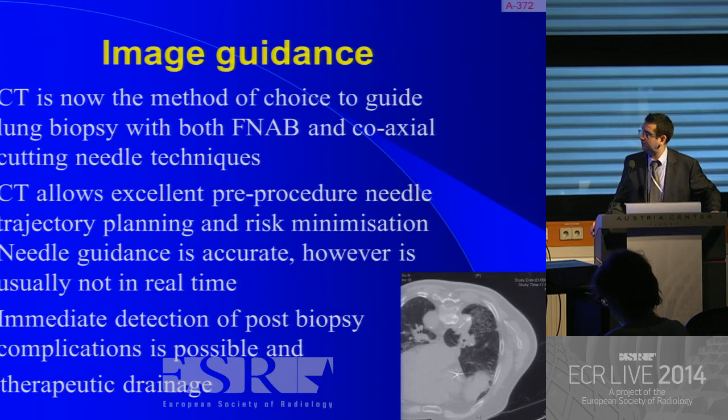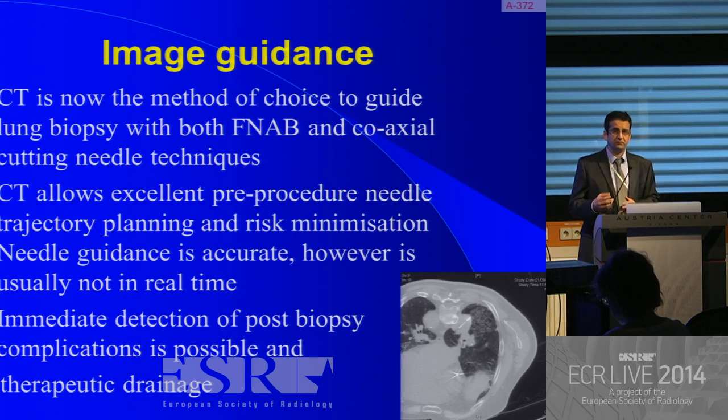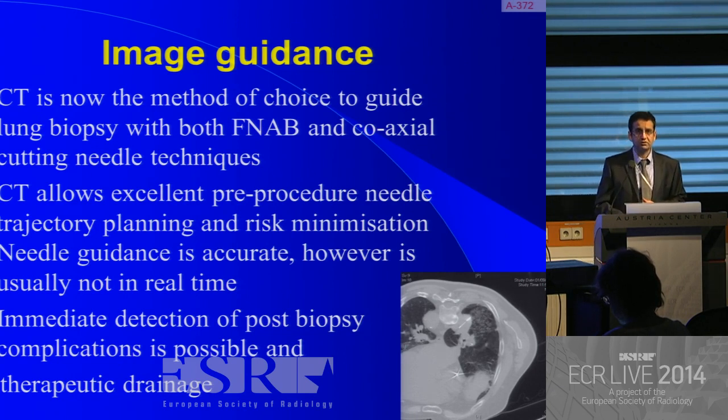CT now, as the chairman has said, is the main choice to guide lung biopsies, although there are other imaging modalities as well, both for fine needle aspiration and coaxial cutting needle techniques. Why is CT good? Because it gives us great pre-procedure needle trajectory planning, and you can use that to risk minimize the procedure. The needle guidance is accurate, and unless you're using CT fluoroscopy, it's not usually in real time. CT fluoroscopy will help you with that, but it increases the radiation risk. CT is also great because it gives you immediate detection of post-biopsy complications, and if need be, you can use this for therapeutic drainage immediately after.